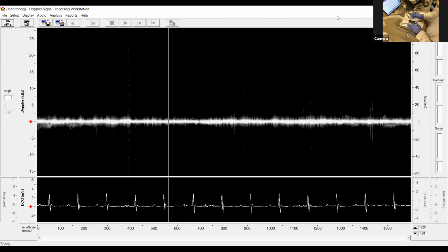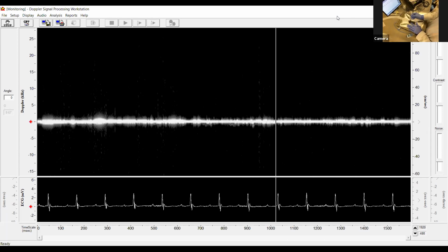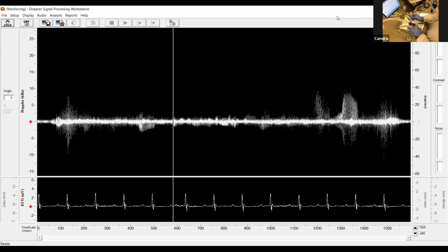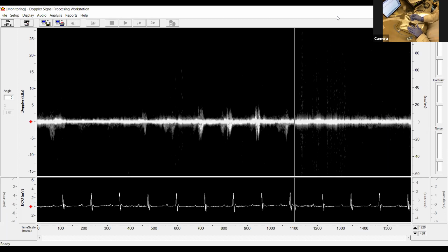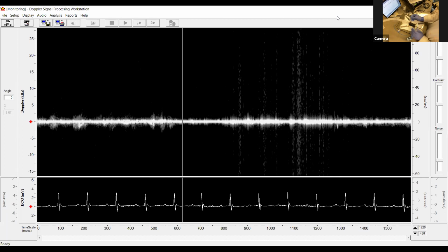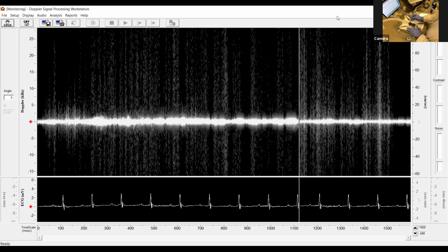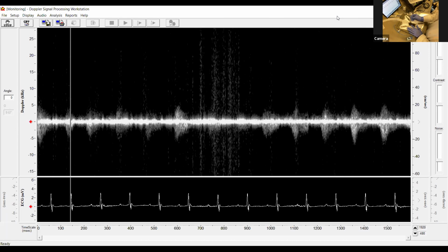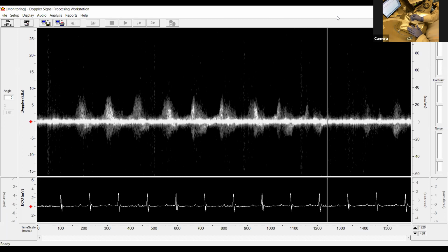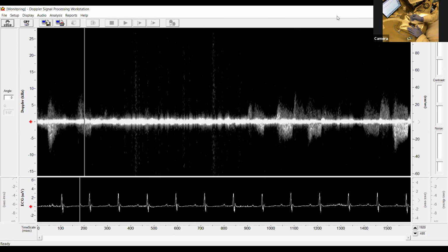Okay, so you'll see the little blue box to Sydney's left-hand side, that's the range. So again, that's the depth from that probe head that we're listening for the signal. You just have a nice shape of it as you pulled the probe back. So you may want to decrease it. Yeah, good. You're getting really close there.